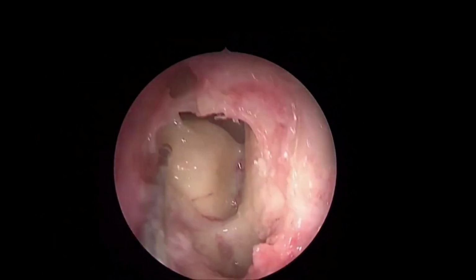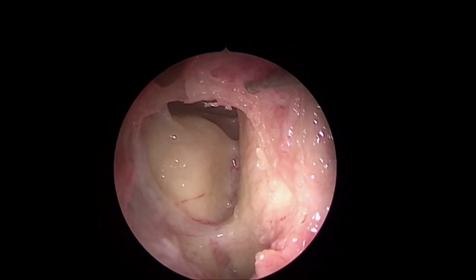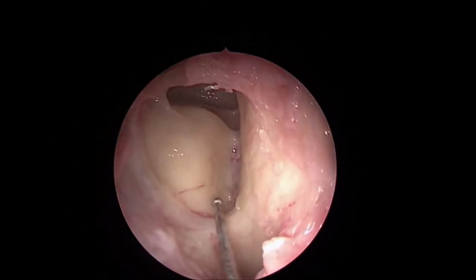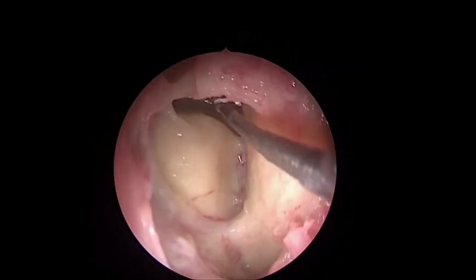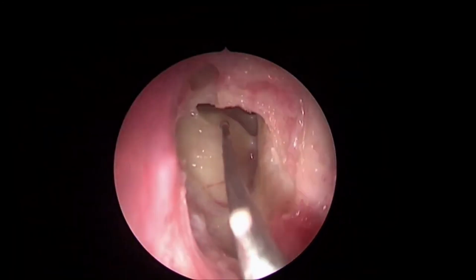So our principle is to follow the limits. See my medial limit flush with the turbinate. Lateral limit flush with the lateral wall. Posterior limit flush with the skull base. And anterior limit to the beak. That is the final size one can give.